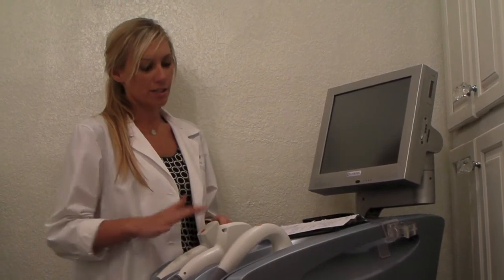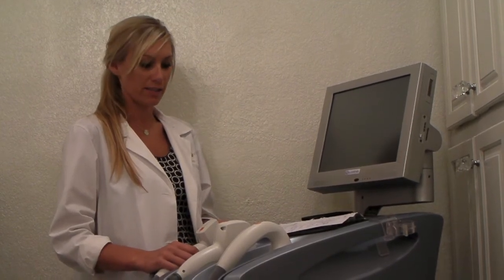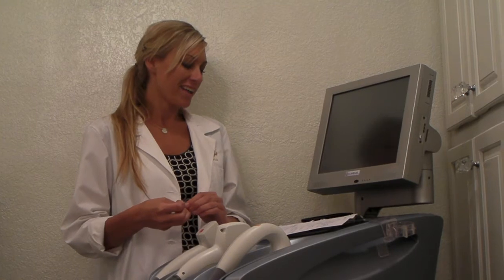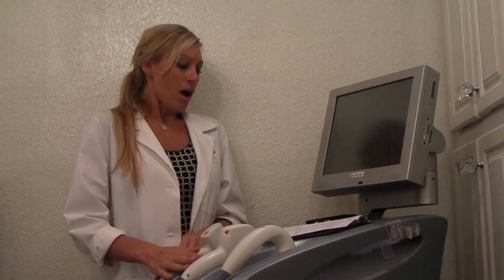One of the major concerns, aside from pain control, is safety with the use of the laser. The laser must be owned by a physician. It's one of the laws in the state of Arkansas where we are. And so under the physician's control and under their medical license, anyone who has another medical license, an RN, an APN, can perform these medical treatments.